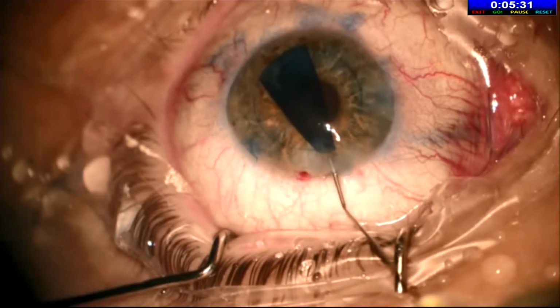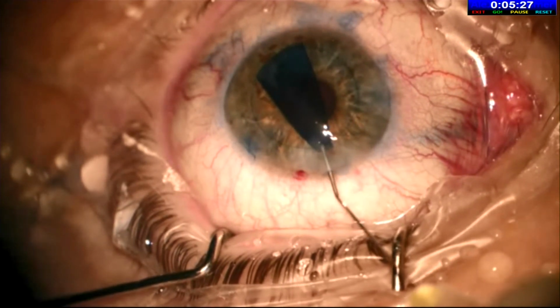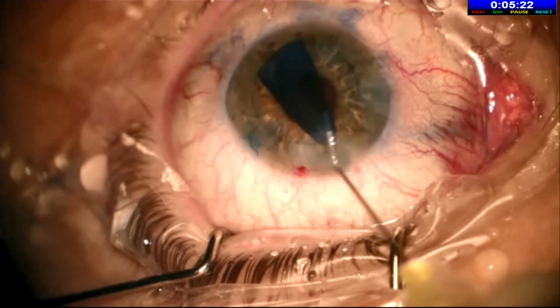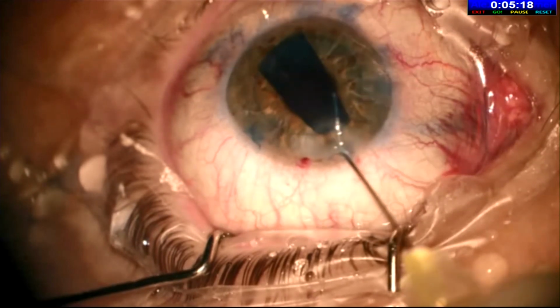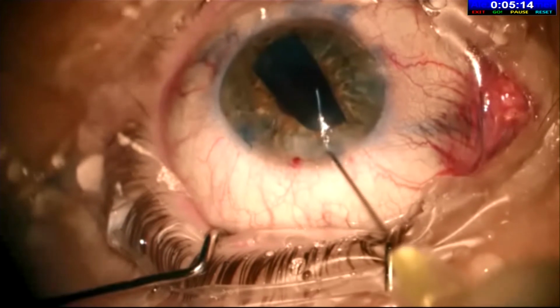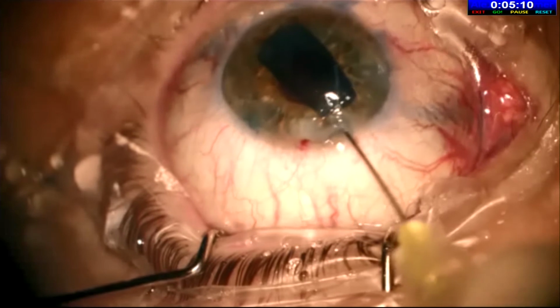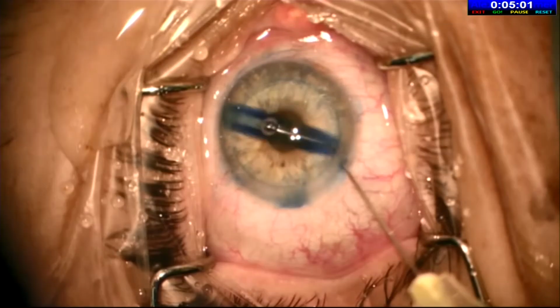So here I want to show you in slow motion a false Moutsouris sign, whereby this actually is upside down. However, we are under the graft and we are manually opening it, but we've opened it upside down. Now the trick is, when you enter the inside of the scroll, before you're underneath the flap, the silvery cannula should remain silver. So that's how not to be fooled.